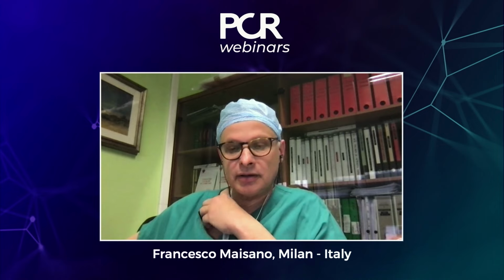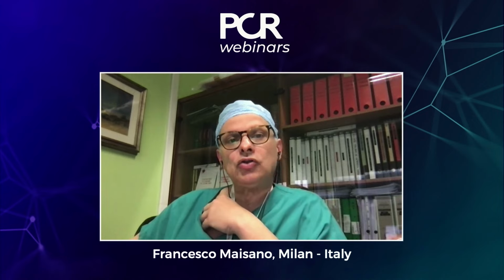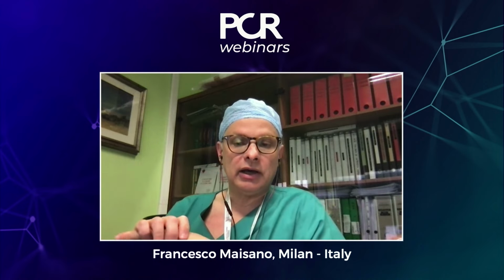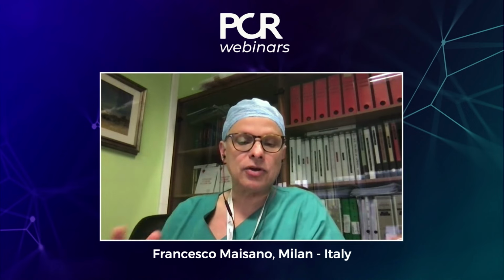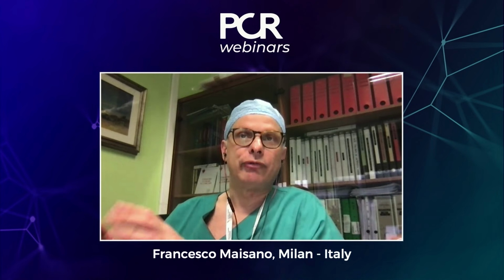Okay, 3D printing. For those who know us, we have been discussing a lot of times, me and Nico, about 3D printing because I was not such a great believer. I think overall 3D printing can be useful, but to be honest, with the recent advances in 3D modeling, 3D printing may become less of a tool to be used, at least for aortic. Mitral and tricuspid can be different, and 3D printing may become a very important tool for pre-procedural training in complex procedures where you want to have a patient-specific simulator. But in my practice, I don't think that 3D printing should become a standard tool for patient selection and procedural planning for TAVI specifically.